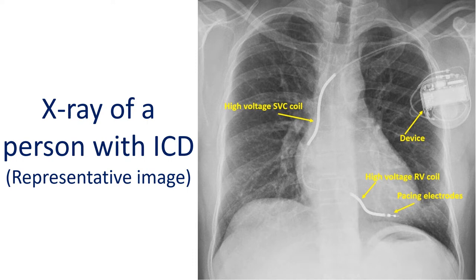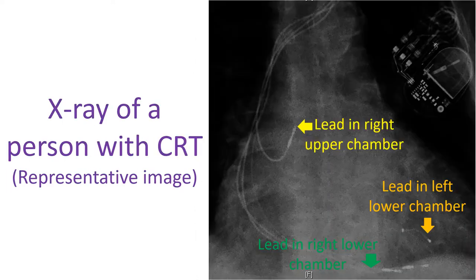ICD is short form for implantable cardioverter defibrillator. It monitors heart rhythm continuously and treats them electrically when needed. If an abnormal fast rhythm from the lower chambers is detected, it will try to suppress it by giving signals at a faster rate. More dangerous rhythms are treated by a direct current internal shock delivered through specialized shocking coils implanted within the heart.